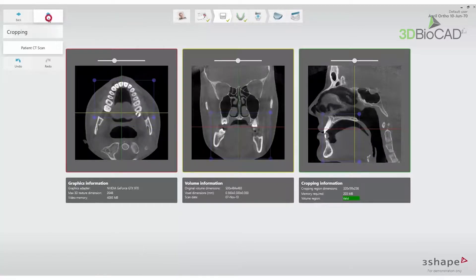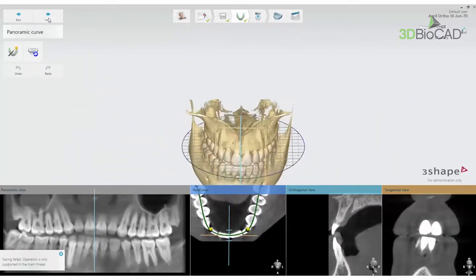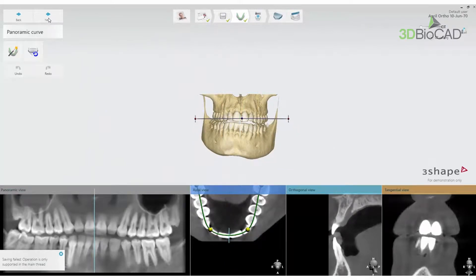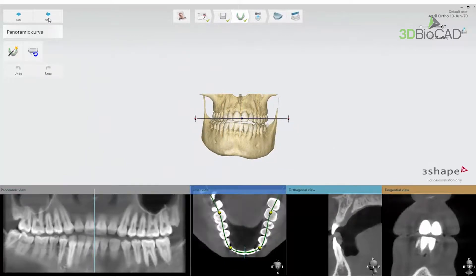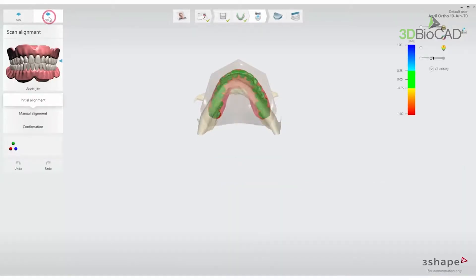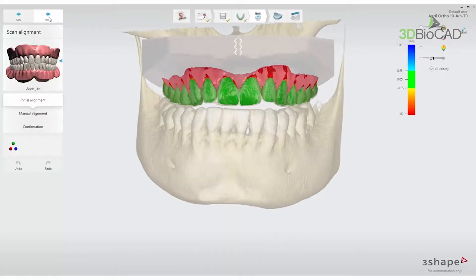Pressing Next will take you to the Panoramic Curve step, during which a panoramic curve may be used for inspection of the case and adjusted if needed. Pressing Next again will take you to the Scan Alignment step.